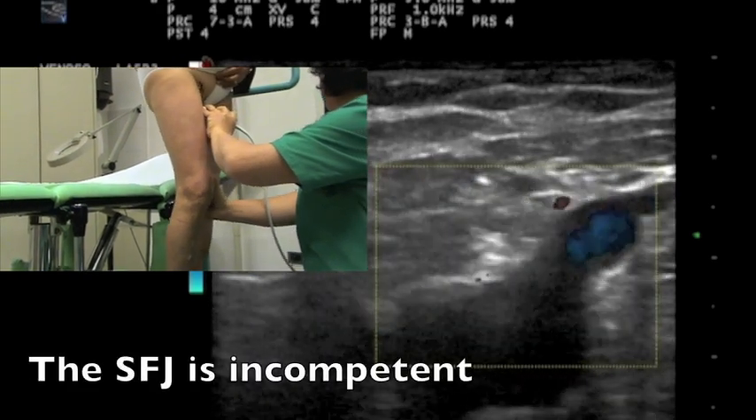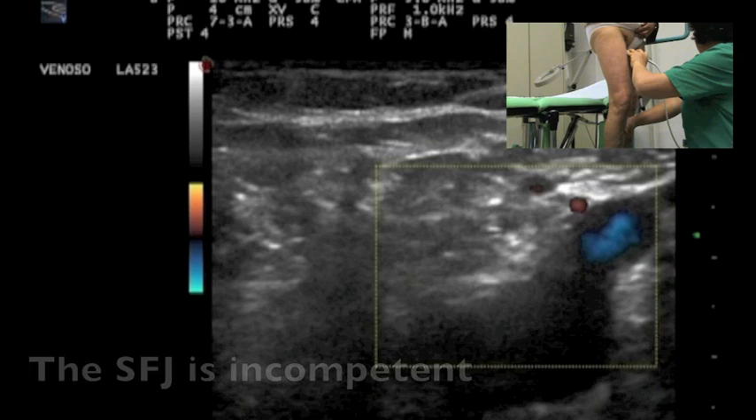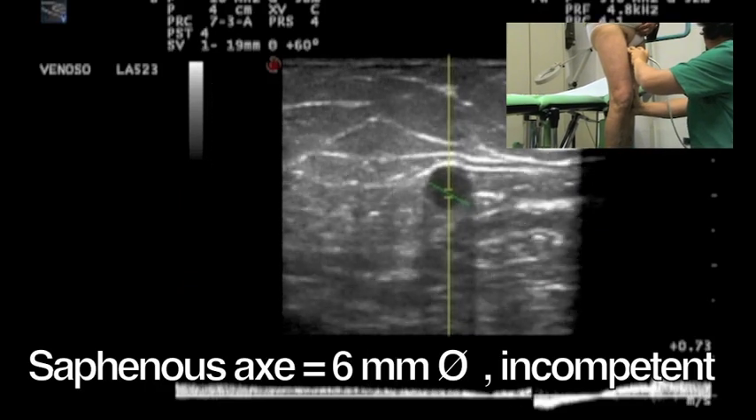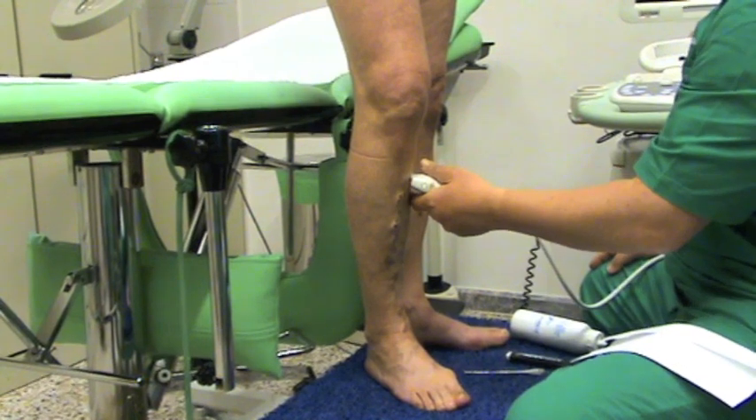We successfully test the great saphenous vein terminal valve and saphenous trunk competence, and then we identify the location of the distal re-entry perforators.